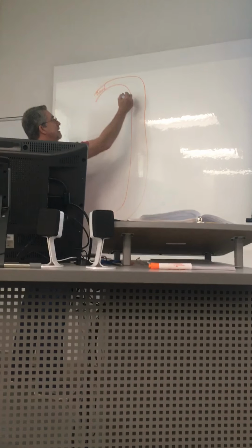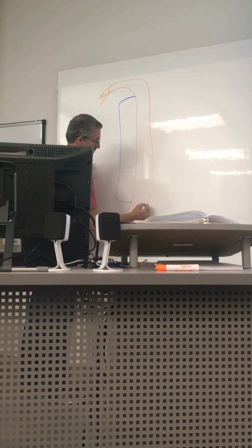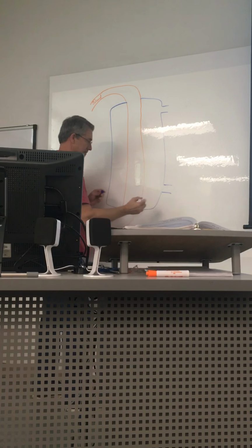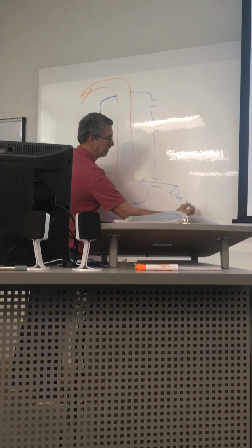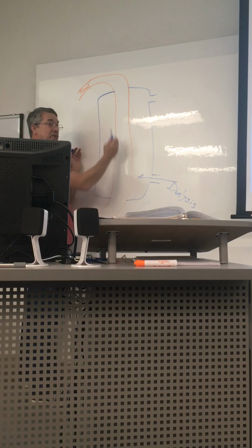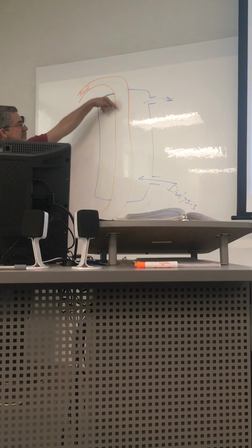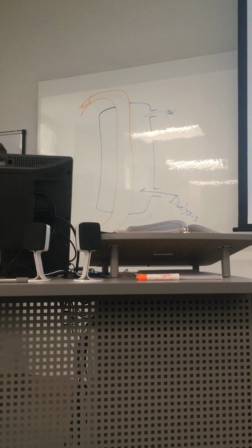Okay. And then around this is this dialyzer, where I can pump in dialysis fluid from here, and it's going to flow all around these thousands of tubes. I've only drawn one of them, and then it's going to flow back out. And this is my blood being directed in here through these thousands or so tubes, and then of course back to the body somewhere over here.